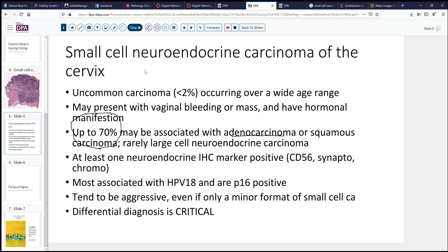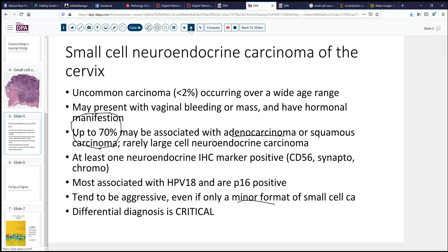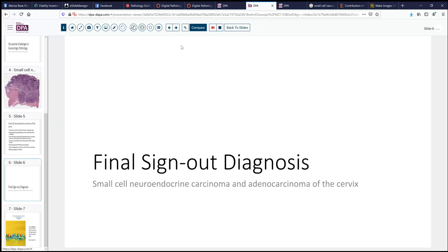In my experience, I've seen it much more frequently in Southeast Asia than in Central Oklahoma. These tumors do tend to be very aggressive, and even if only a minor component is the small cell tumor, you have to be very mindful not to miss this. Differential diagnosis is critical — differentiating from small cell squamous cell carcinoma as well as other neoplasms like rhabdomyosarcoma would be important, because treatment will be vastly different. Our final sign-out diagnosis today: small cell neuroendocrine carcinoma of the cervix with associated adenocarcinoma of the cervix.